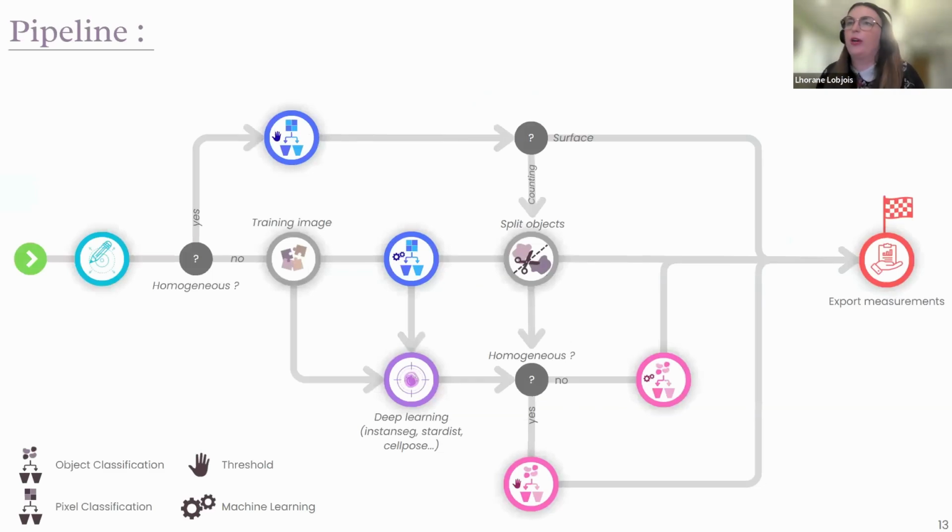It was a quick reminder and introduction. So today is to talk about pipelines. That's why I would like to show you this one. I tried to create a kind of mind map of pipelines in QuPath, depending on what I want and the question I have to answer, my biological question. So the beginning is to create projects. You will see everything after, but it's to help you understand.